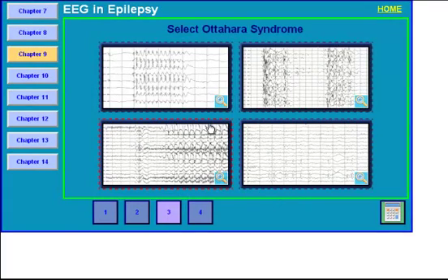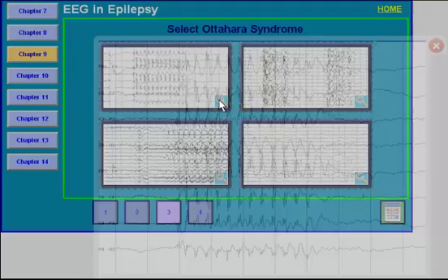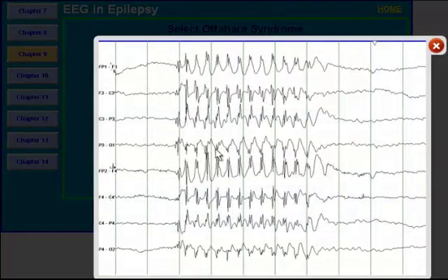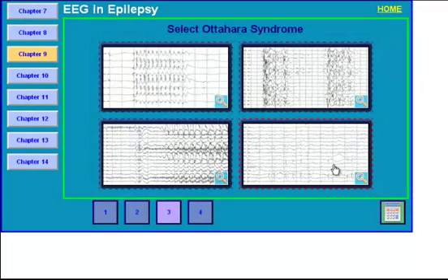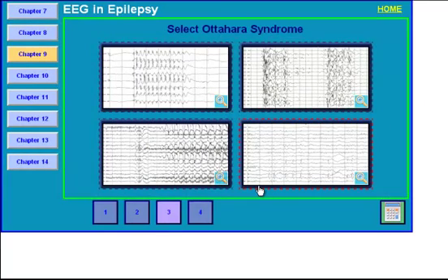I'll show you one more EEG and then we'll stop here. This EEG pattern, what you see here is almost 3 per second spike and wave. This is a pattern that is seen in patients with generalized epilepsies such as absence seizures. So I'll stop here and we'll have another discussion maybe in a few weeks. Thank you for your attention.